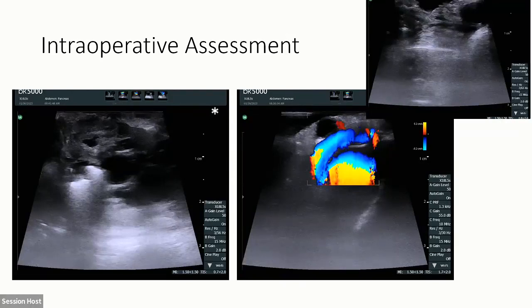And then here I'm actually ultrasounding the area of the pancreatic head. So I'm at the position of doing the Whipple procedure where now I've got my hand behind the uncinate process of the pancreas. I'm pulling the pancreas towards me as I'm dissecting the uncinate off. So I'm pulling the cystic area out towards me. And you can kind of catch a shadow. One of these pictures has got this big stone. These are my fingers actually underneath, and I'm catching a little shadow of the stone, which is up at the top here.